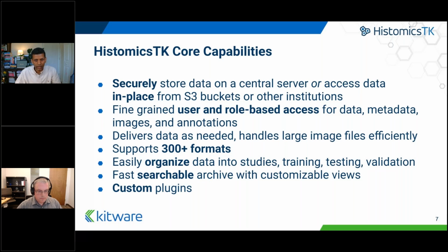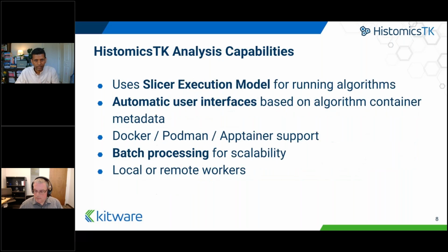You can re-encode massive images in a standard format if needed, but it's not required for basic usage. Once your data is imported or uploaded, you can organize it in countless ways. And here's the important part. None of these require copying those large underlying files. Everything remains searchable and customizable views, and you can extend functionality with custom plugins.